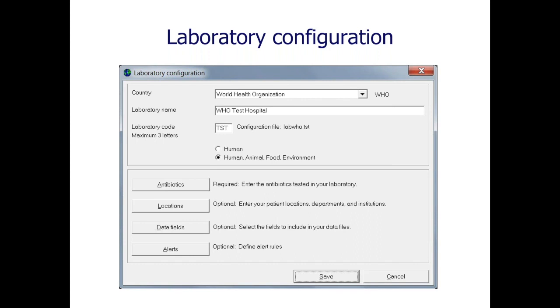Then you can enter locations. Location means what you want it to mean. In a hospital, location typically means the name of the ward or clinic - ICU, medicine male, medicine female. If you work in a national center like EPHI, the location might be the name of the hospital, town, district, or region. In an animal laboratory, location might be the name of the farm, market, or veterinary clinic. In a food laboratory, it might be the name of the restaurant or market. Location is a very general word - you define it in the way most useful to you.